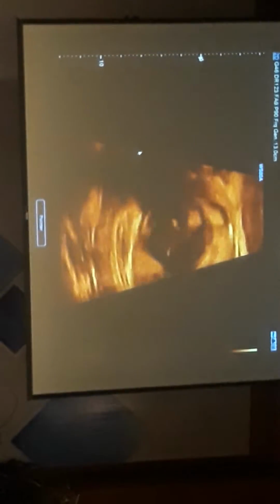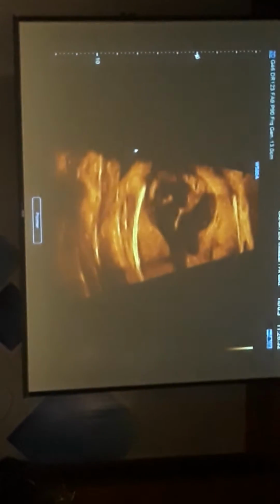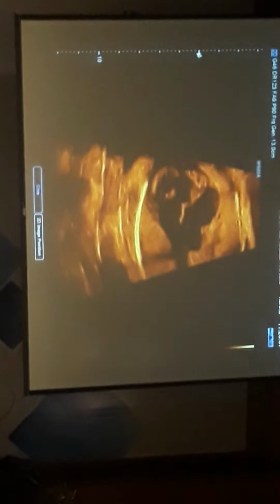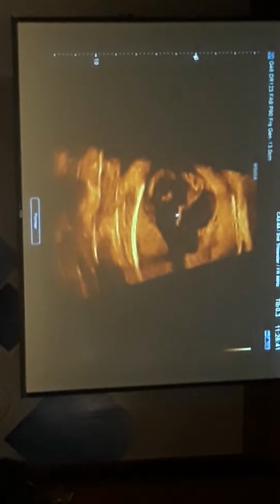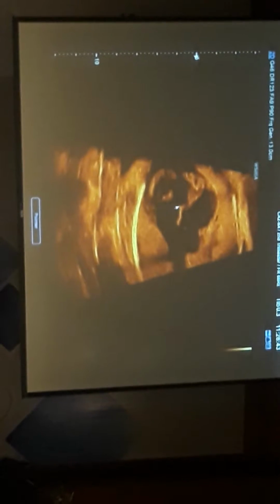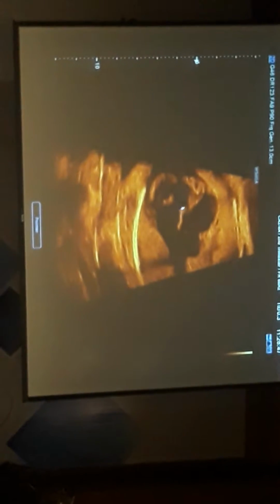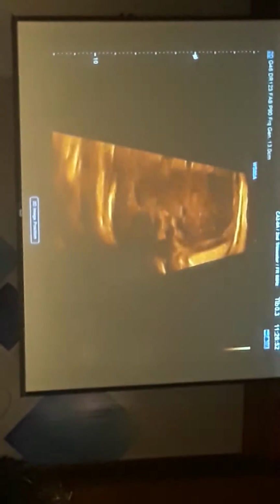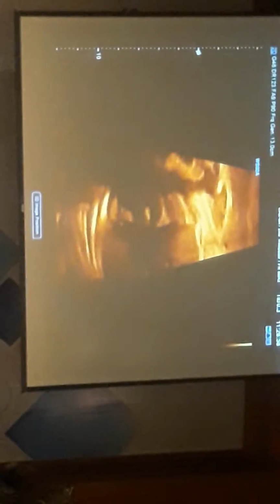So I'm going to have to look at one part at a time. For instance, here I'm seeing the crux, the lower part of the atrial septum, and then this one inlet, and then this looks atretic. So you can only see one part at a time because it's painful for her to be pushing harder.